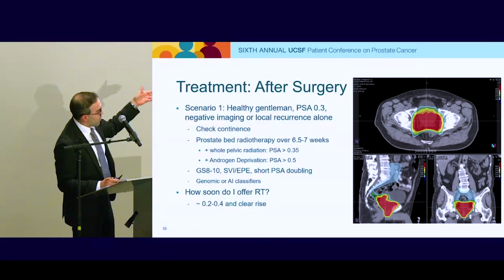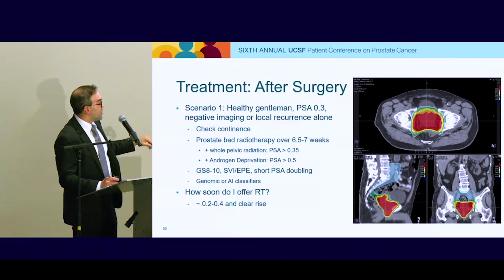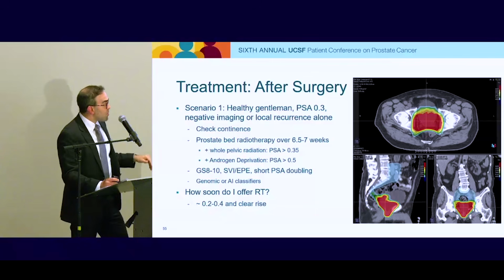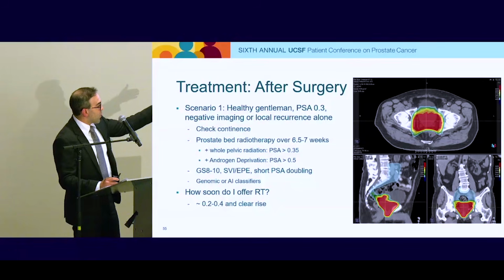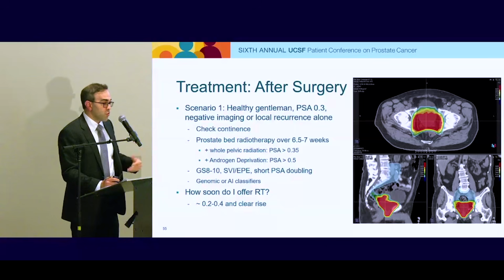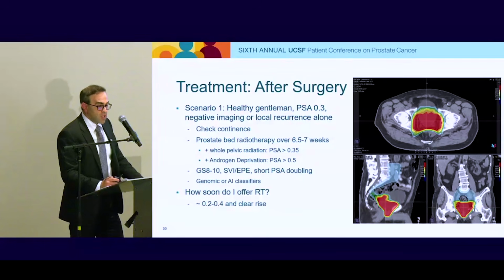If you imagine the side profile there, the image at the bottom left, it looks kind of like a toilet bowl seat almost, right? And then to a lower dose, that lighter blue up there is how we treat the pelvic lymph node spaces that are at risk, right? And again, if you look at that bottom left figure, the rectum, which is behind it, has been spared very nicely, because we really try our best to reduce the amount of rectal dose and bladder dose, pushing off the bladder, which is right above it, right? And that's just because the technology, as discussed earlier this morning, has really come a very long way.